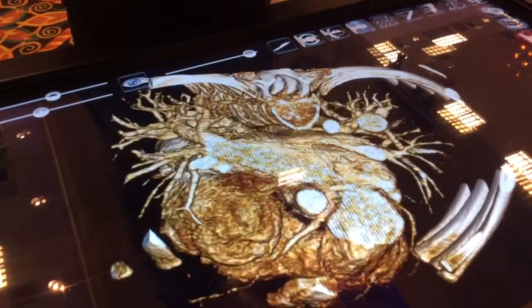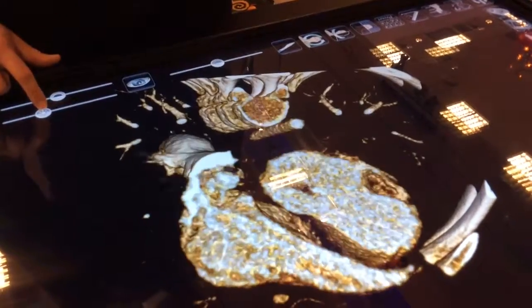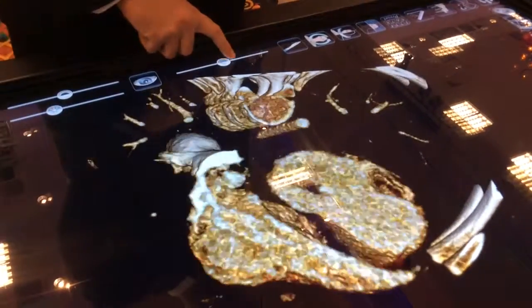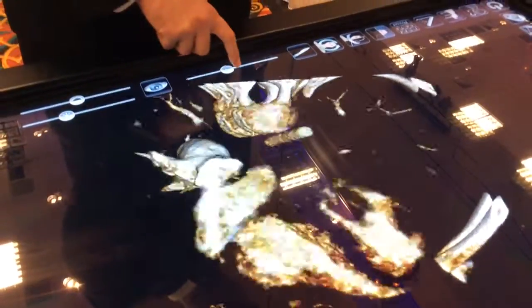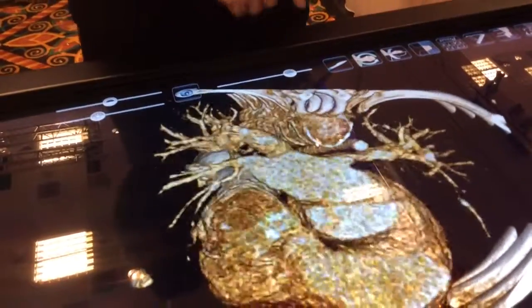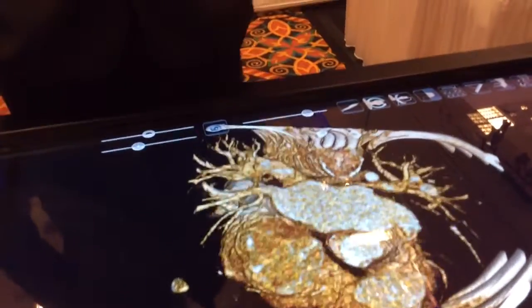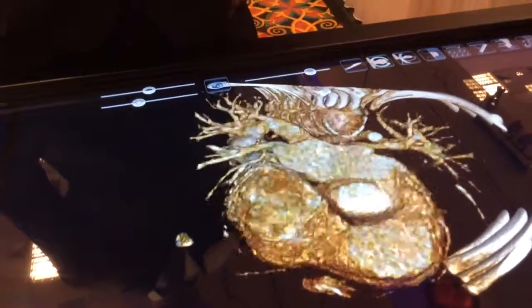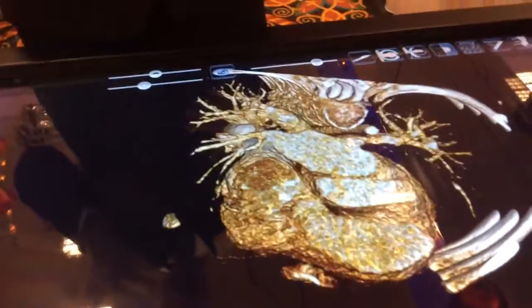And we can still cut into this data here. And so you can go down, you can see the different compartments of the heart. You can show students how you can trace blood flow here. You can see vessels. So can you upload different models? Let's say if you had access to a file of someone who had a cardiomyopathy or a baby with a tetralogy of Fallot. Or we actually have tetralogy of Fallot. You've got tetralogy in there. Wow. But cool. You have transposition of the great vessels and all that other good stuff.